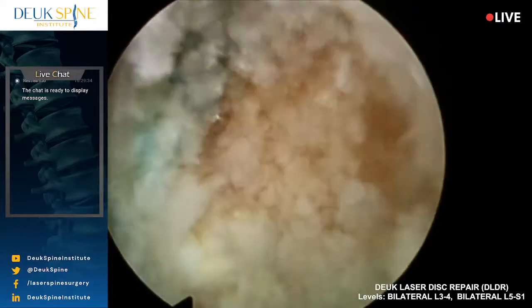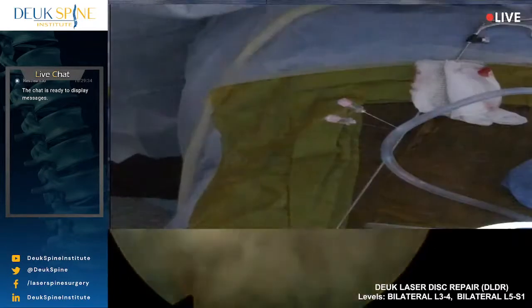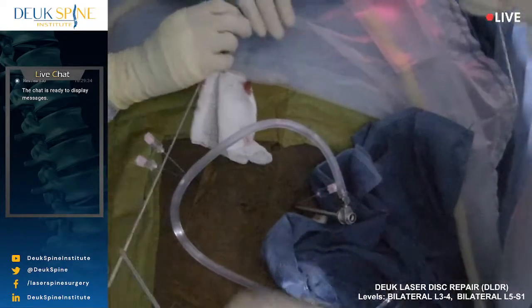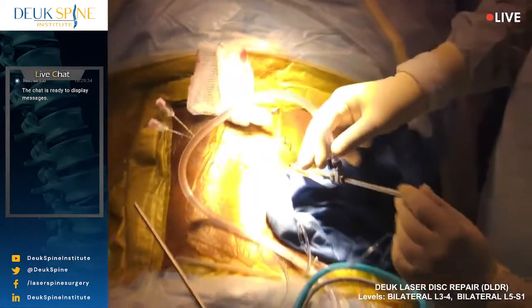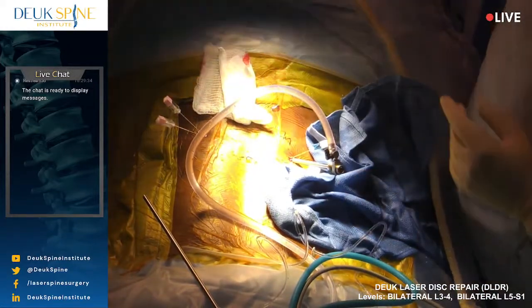We're done. Come off, hold on. Scope off, please. Lights on, please, thank you.